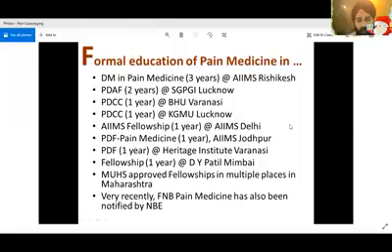Dr. Chetna, but what I would feel is, except for post-operative pain relief, where we might be using a single shot, for most other indications, especially to manage chronic pains like those of rib fractures or neuropathic pain, a continuous block gives us much more leverage, much more pain relief, which lasts almost 5 to 7 days with the catheters. I find that the catheter placement is quite easily done and is not with too many complications.